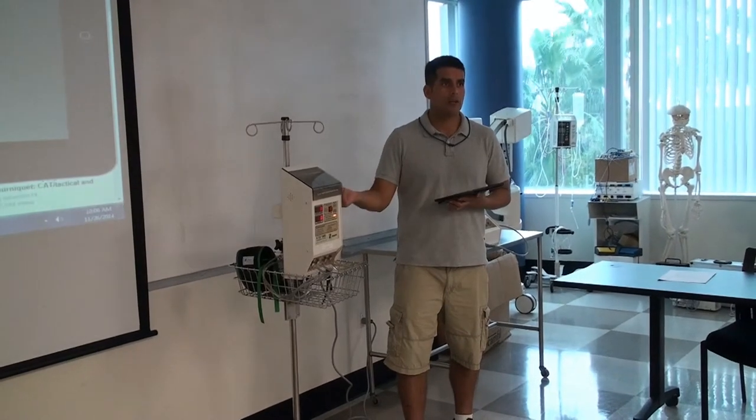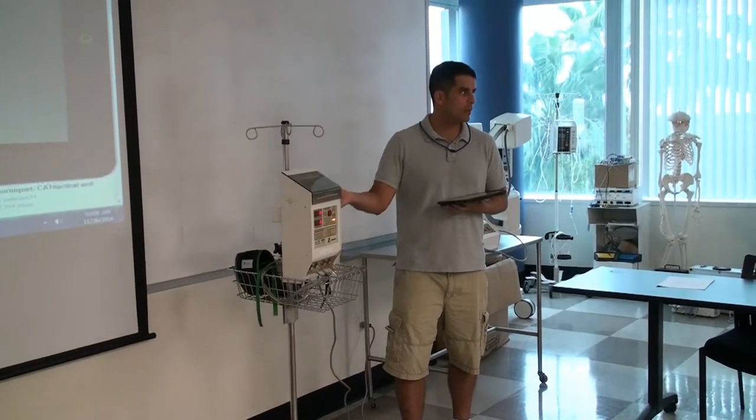Now we're going to start with the hands-on training, and I invite everybody to open the unit.